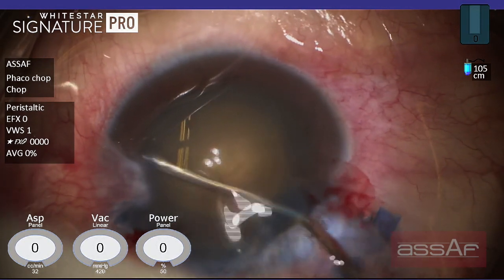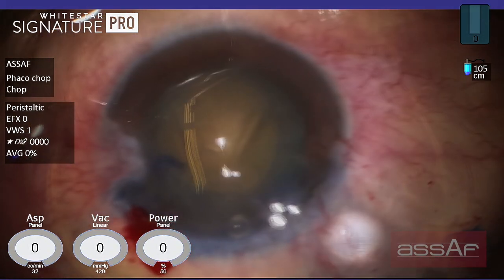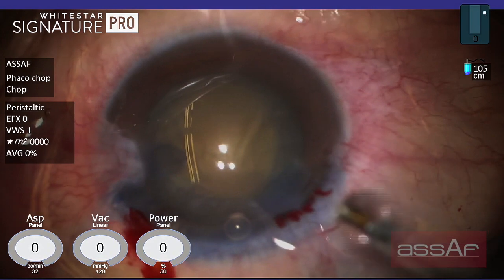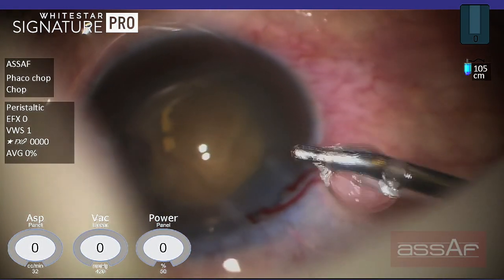Now proceeding to hydrodissection, trying to rock the nucleus to make sure that the nucleus is completely free within the capsular bag. Now proceeding to phacoemulsification.